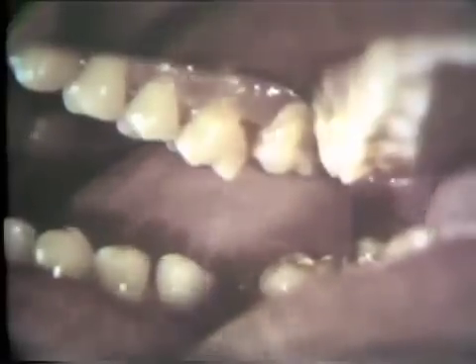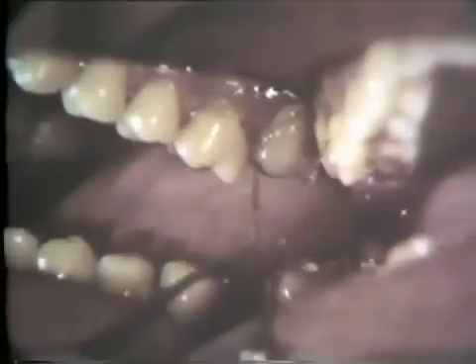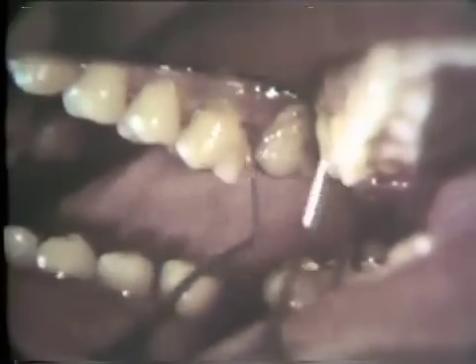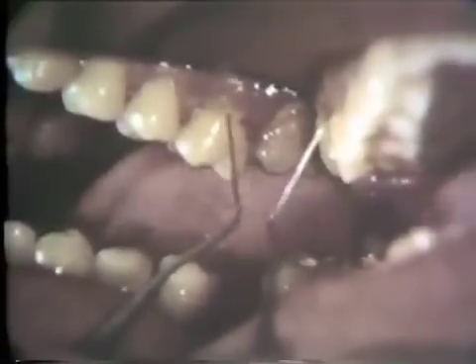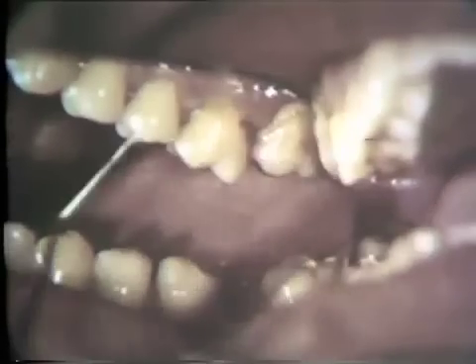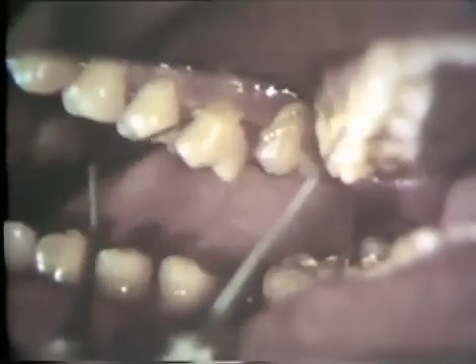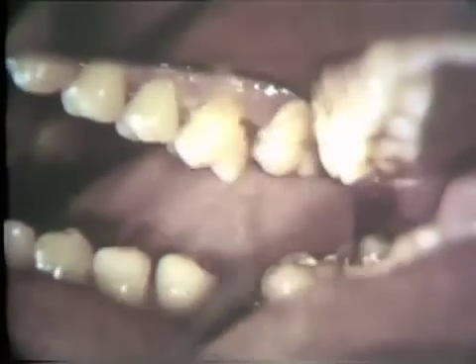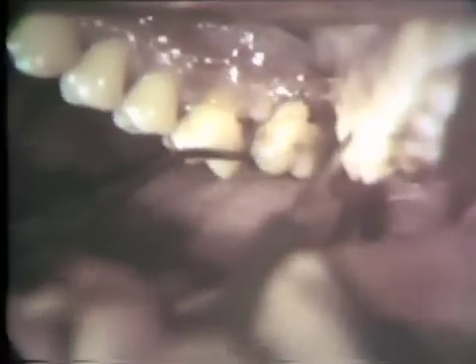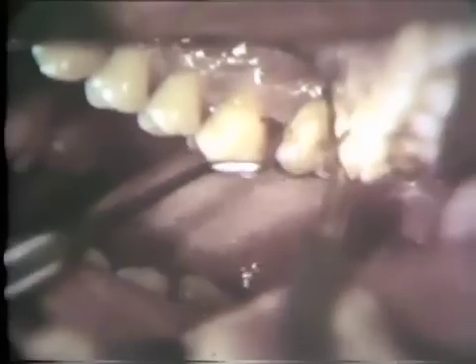The distance between the free gingival margin and the cemento-enamel junction on tooth number three is determined distobuccally and mesiobuccally with a University of Michigan number ought probe. If the cemento-enamel junction cannot be located due to calculus, the calculus must be removed.